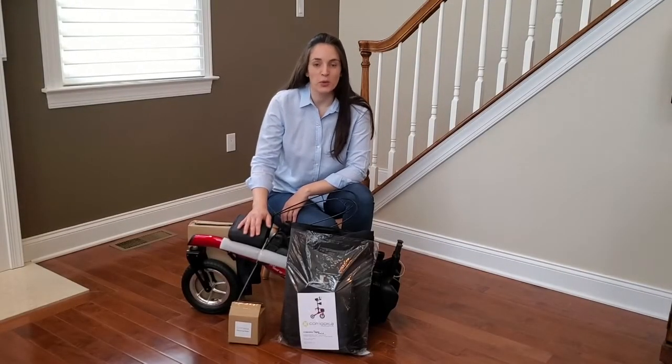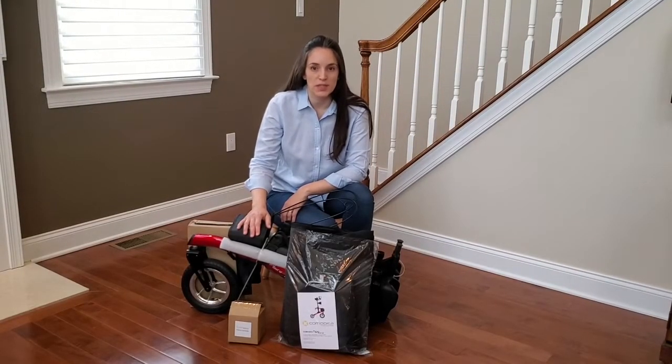Hi! Today I'm going to show you how to assemble your Comodita Tipo stand-up walker.